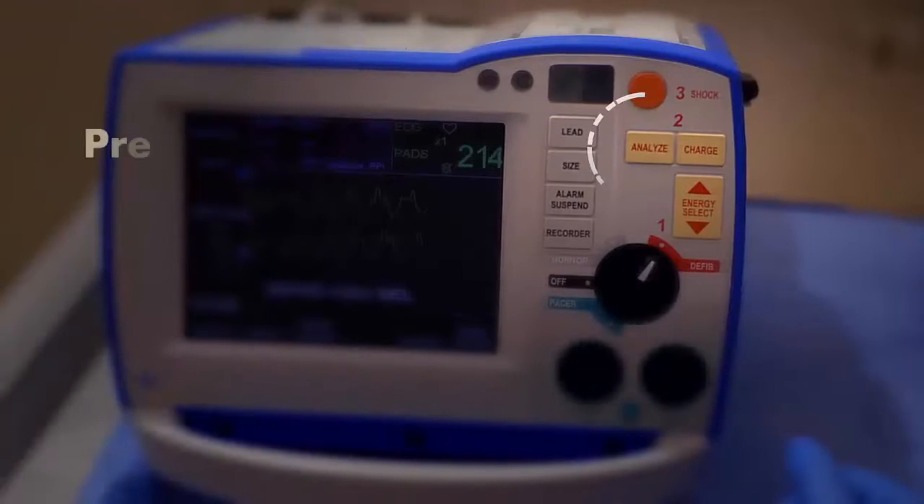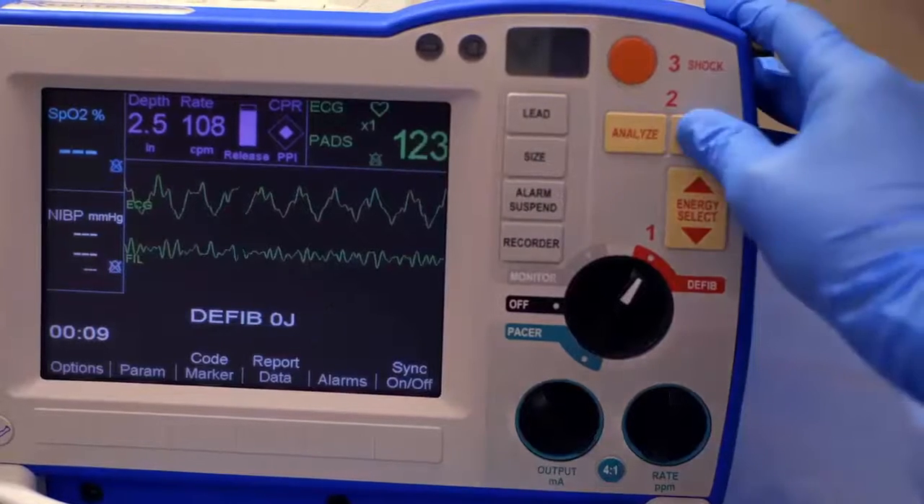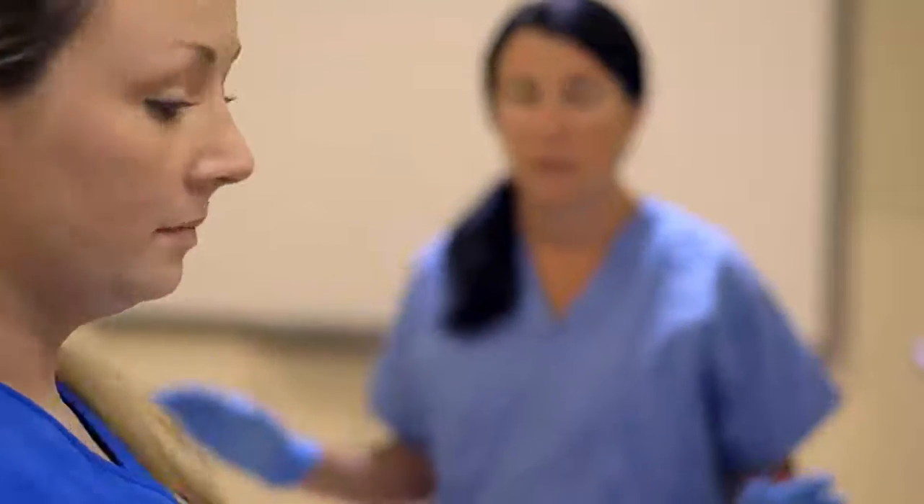Step 2: BLS providers press Analyze and follow screen and voice prompts. ALS providers press Charge. Before shocking the patient, ensure the environment is safe for defibrillation. Clear. Step 3: Clear. Press the illuminated shock button.